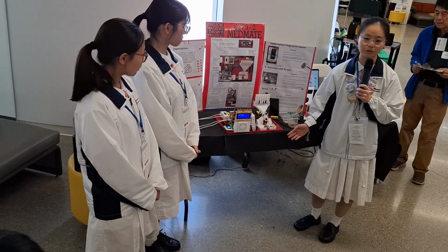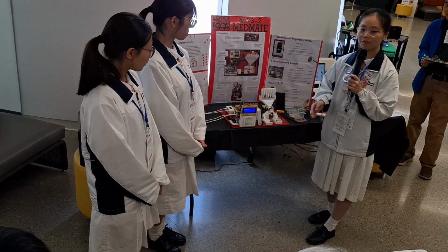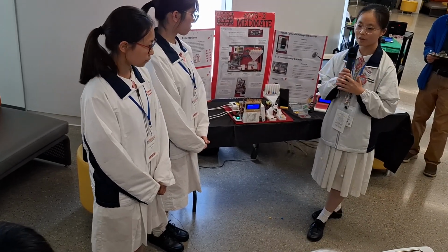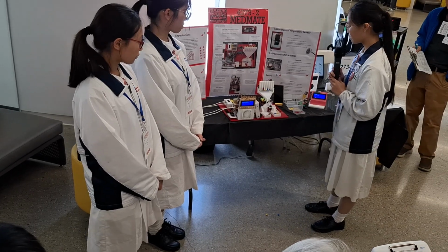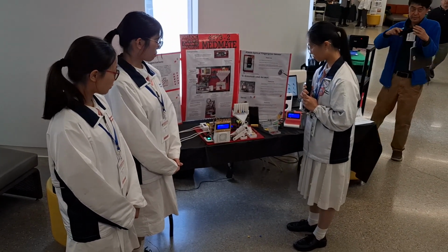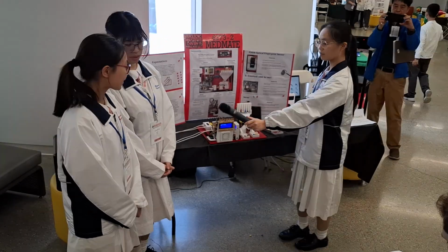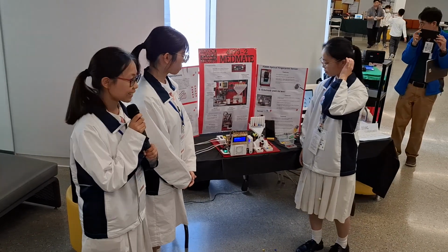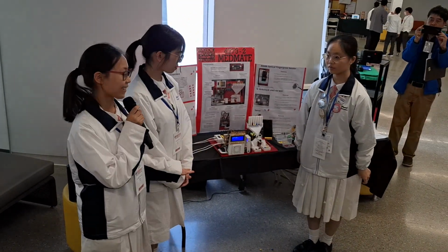The pills will be cut by the servo to reduce the risk of injury from cutting. The pills on the left-hand side will be cut. Please be careful. The cutting of pills has finished. You can have your medicine now.